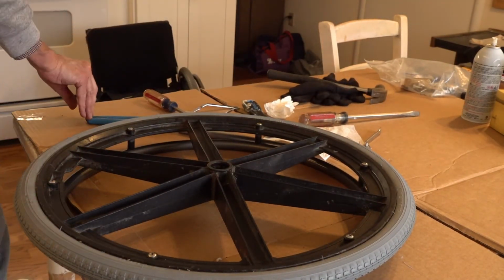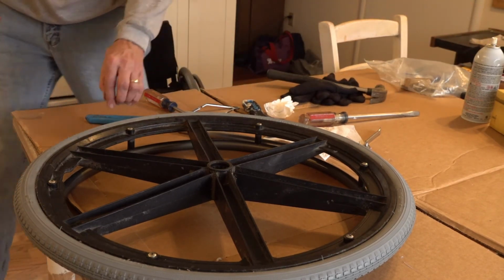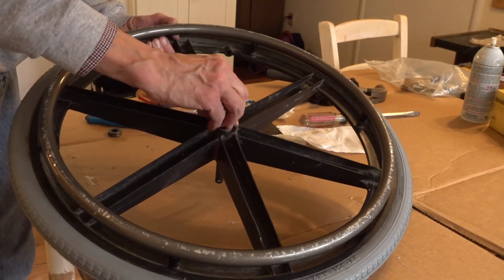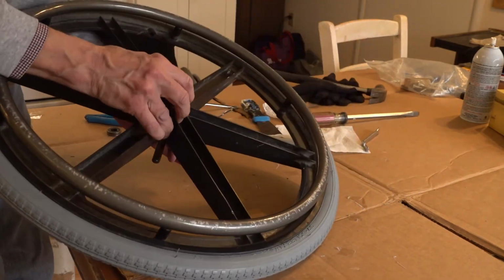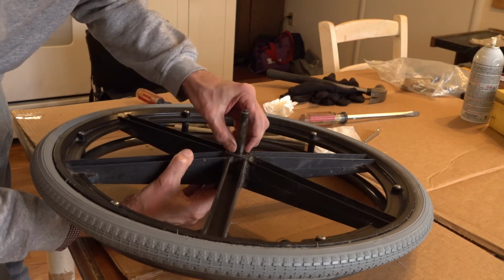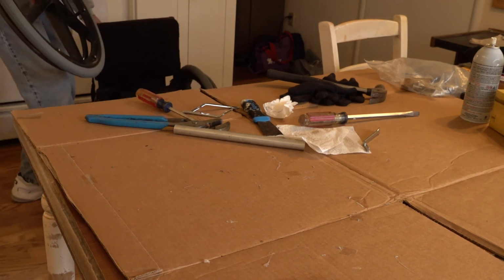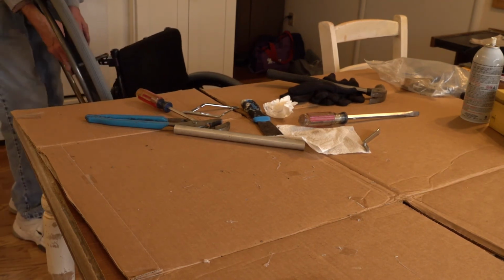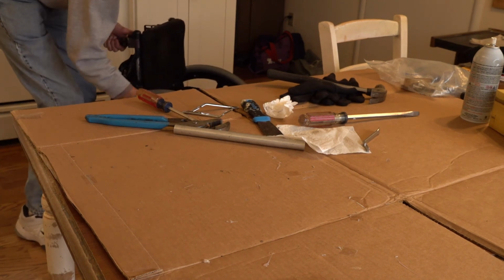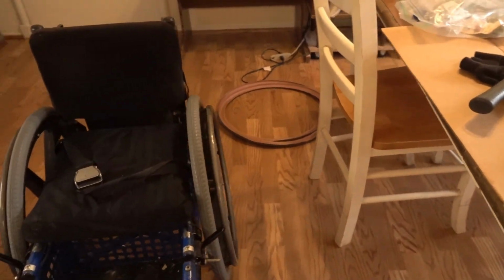Okay, get our axle attachments here. Our bearings, put the bearings back in. And put it on there. And here's our chair with two new tires on them.